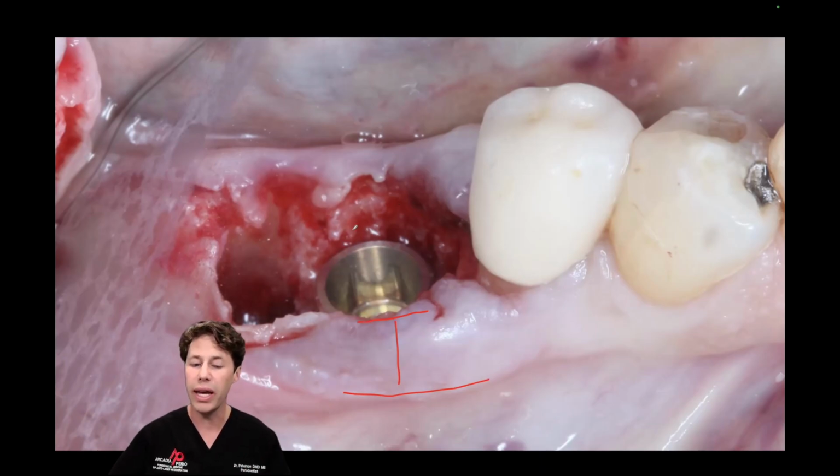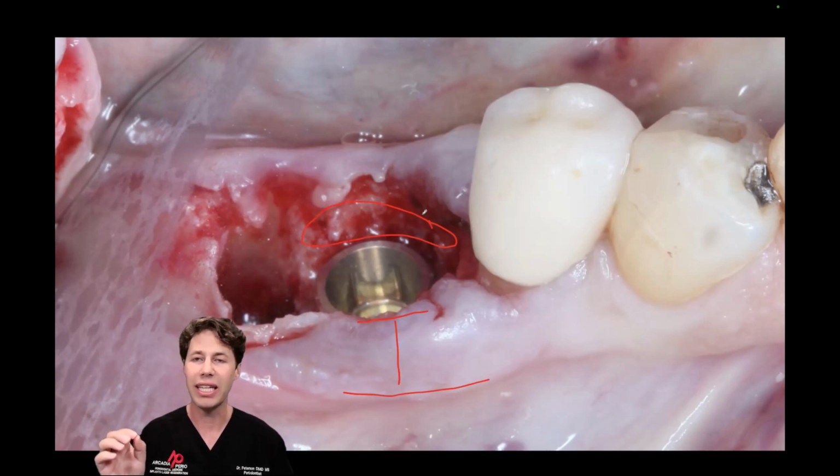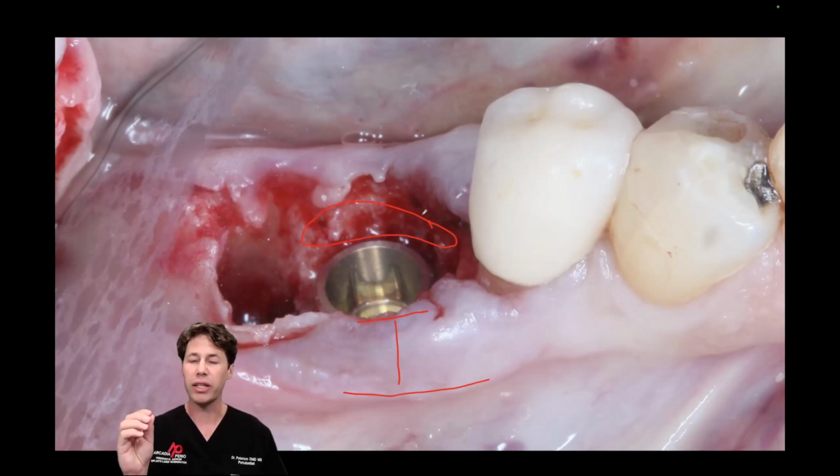That is okay. But the one thing we need to be mindful of when we're looking here is that all of this bone here can prevent the proper seating of a healing abutment. So remember, when you're placing your healing abutment, whether it's a PEEK healing abutment or a traditional titanium abutment, it should screw in very easily and then just stop. You shouldn't have to tighten it really hard, right? It should go, go, go and stop. That's how you know it's fitting passively. Otherwise, you're going to be putting pressure necrosis on the bone if you continue to tighten it and you haven't alleviated the bone around the implant body. I have a trick to help with that.